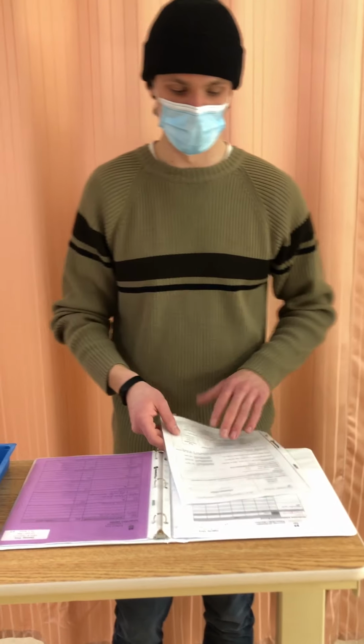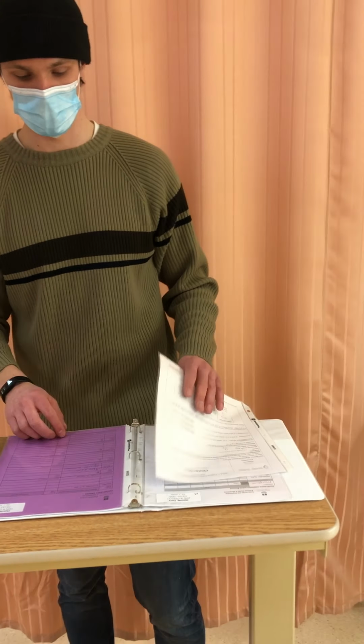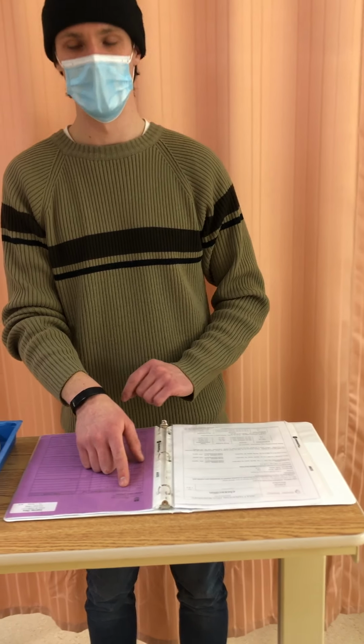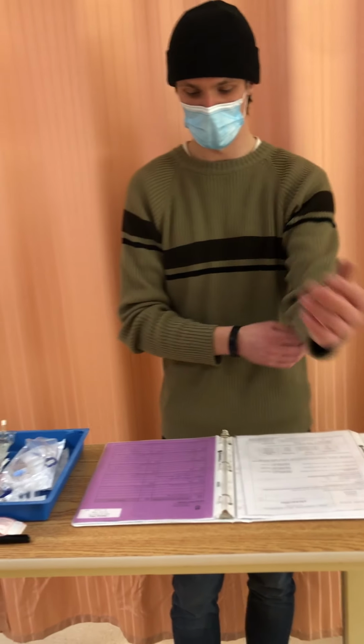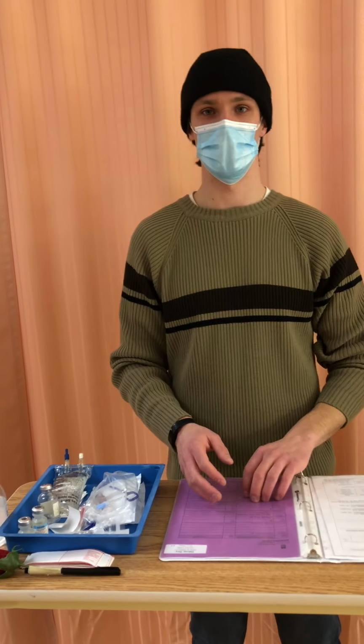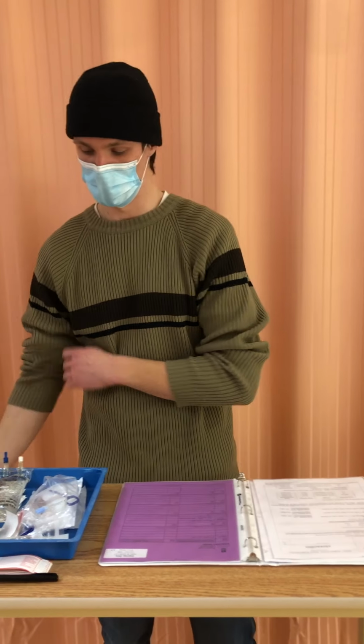So I see here that Dory is allergic to morphine, and I see that the physician has ordered cloxacillin for her cellulitis infection on her left arm. So I can go ahead and, prior to this, I already compared the MAR to the physician's order, and it has been properly transcribed. So I can go ahead and do my first check.